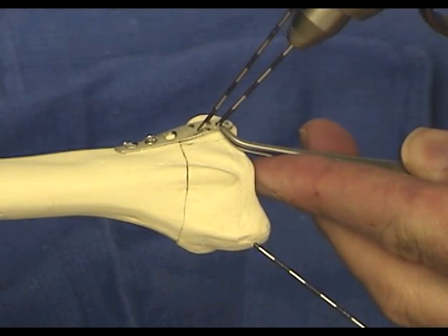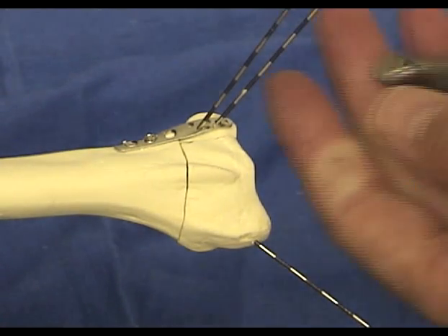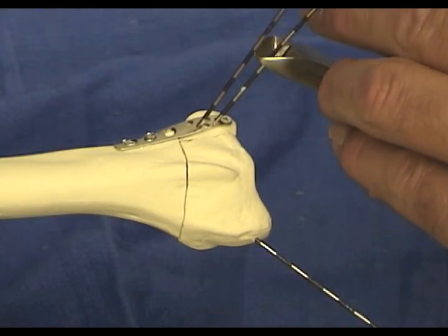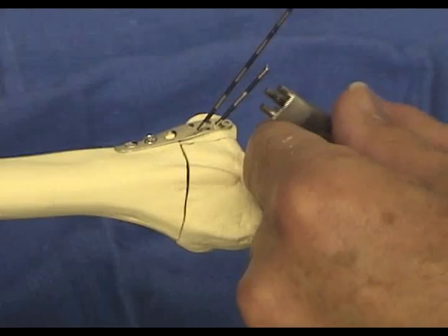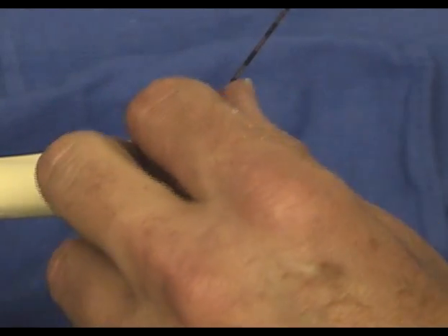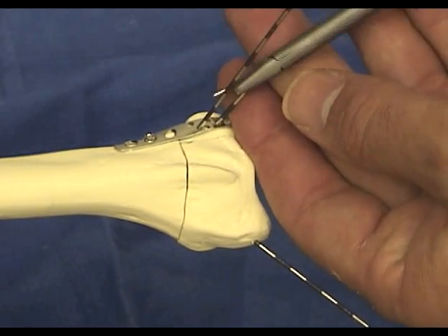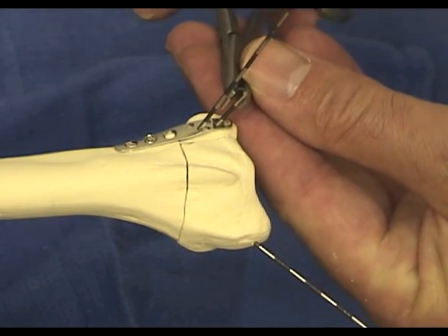The mark indicating the proper depth of the pin is noted and the pin withdrawn one complete pair of bands. The pin has cut a pair of bands distal to this mark, and the pin bending tool is placed so that the mark is straddled by the bottom two posts of the instrument. The initial hook is made, taking care to create a straight hook and avoid a shepherd's crook appearance.